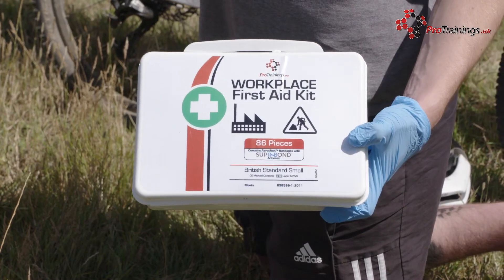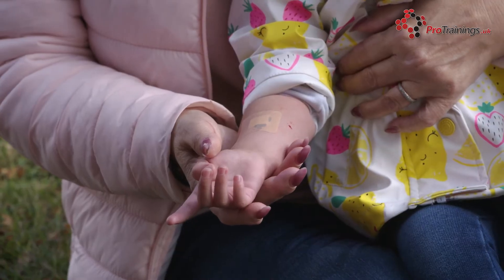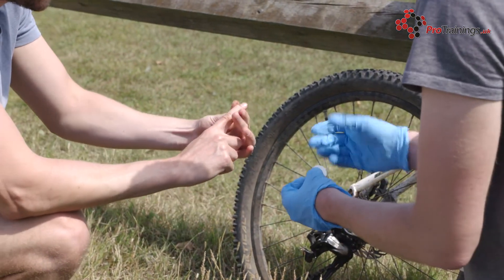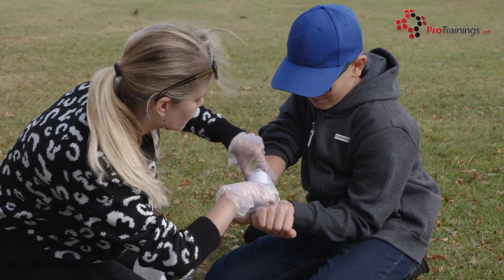Plasters are always sterile and you will find them in most first aid kits. There are different shapes and sizes, from round plasters for small wounds or sores to shaped plasters to allow them to fit over the end of your finger. Make sure you are wearing gloves to ensure that they are kept clean and you do not add infection. You may need to clean the wound to remove any dirt or grit.